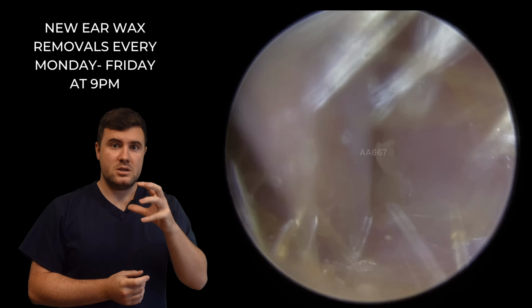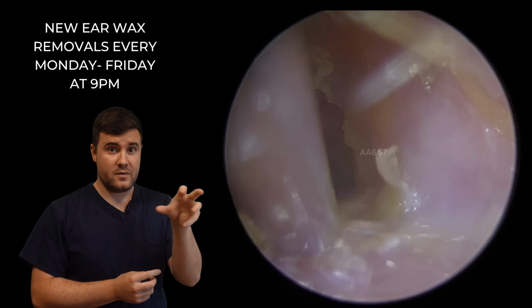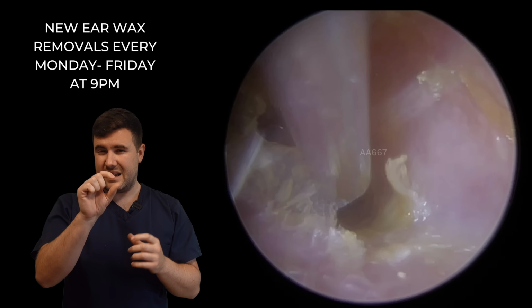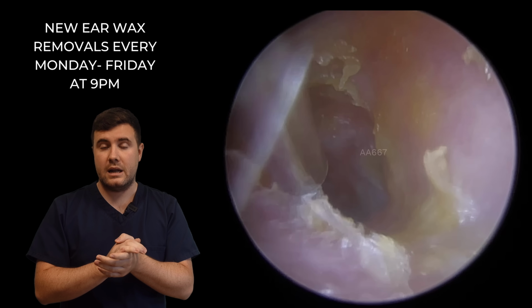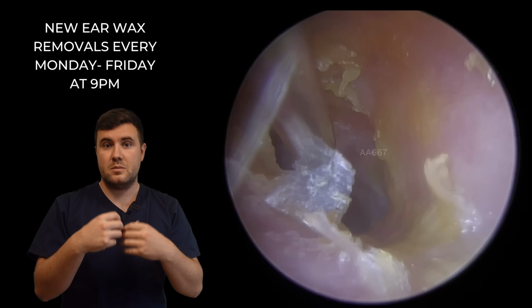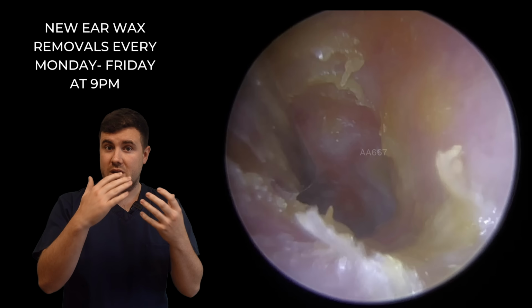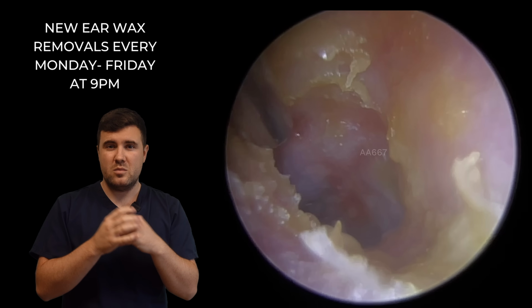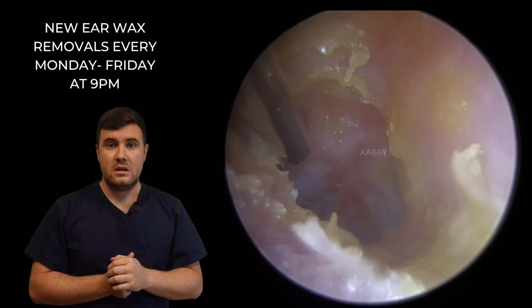Now, as you would know if you've seen some of our last couple of videos that we've released, removing these very fine, thin layers of skin which are still attached to the ear canal, we do get some clarinetting from the suction tube, which is where the skin vibrates in the tube very rapidly, and it can cause a horrible whistling noise, which is quite uncomfortable for the patient.